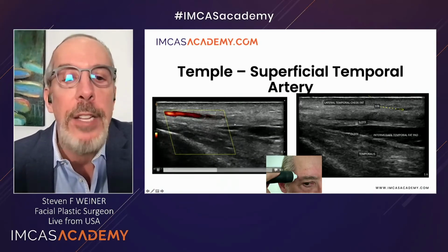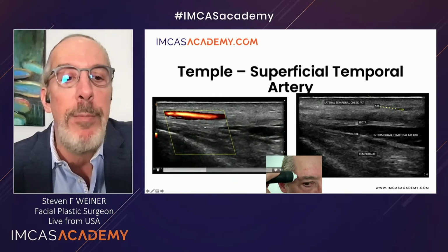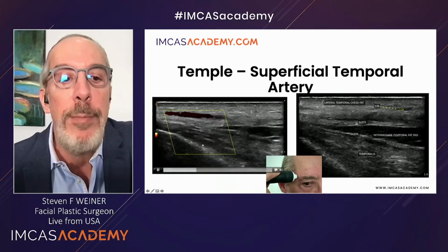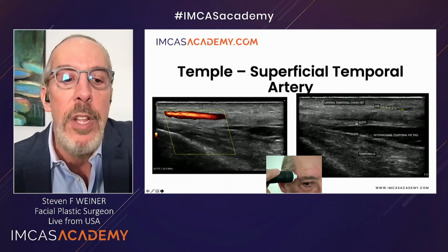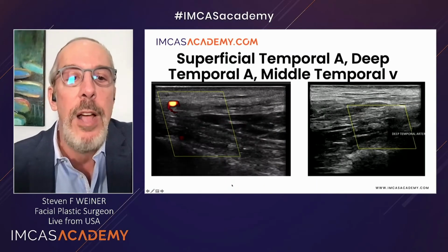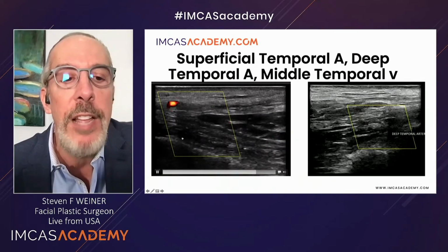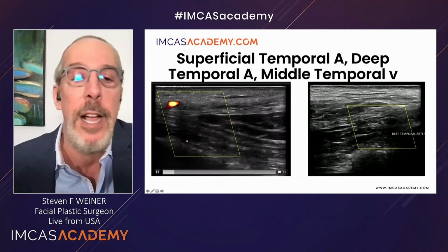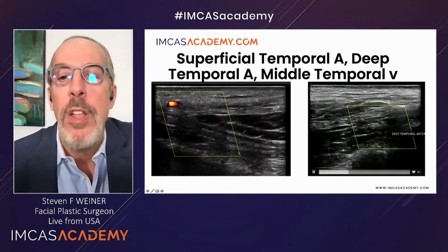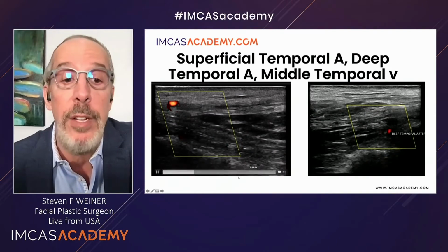And I like to place my filler in this zone right here between the superficial temporal fascia and the deep temporal fascia. Other people like to place it superficially, and some people like to place it deep. But I'm going to show you the deep injection isn't as safe as you think it is, because what you're going to see right here is that deep temporal artery is at risk when you do that gunshot technique or the one up, one over technique. So just be careful of that deep temporal artery when you're doing those deep injections onto the bone.